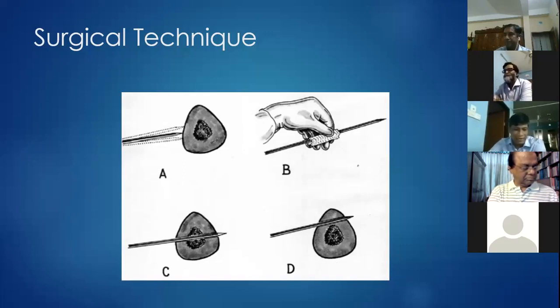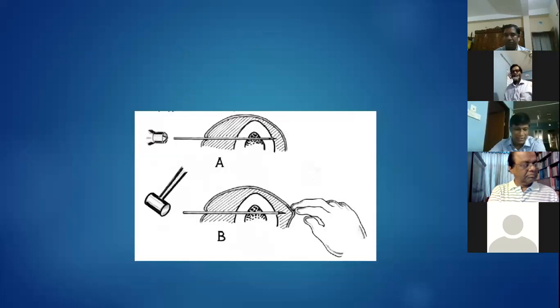After passing the far side of the cortex, the drill is disconnected. And wire insertion is completed by hammering with light taps to prevent perforation of the major vessels and nerves.